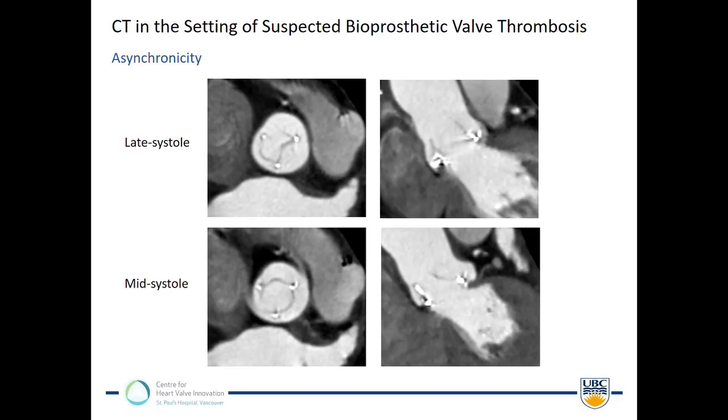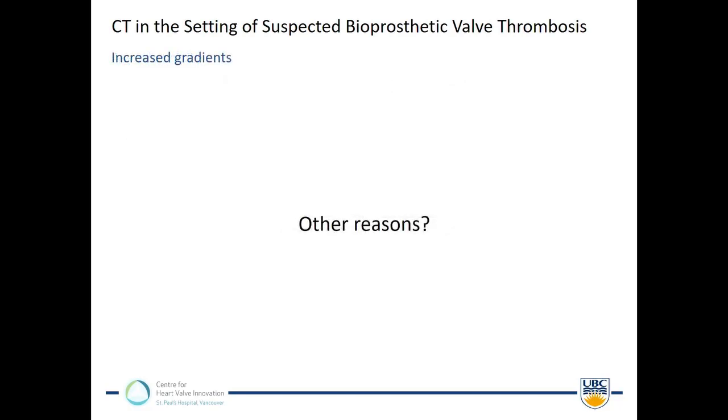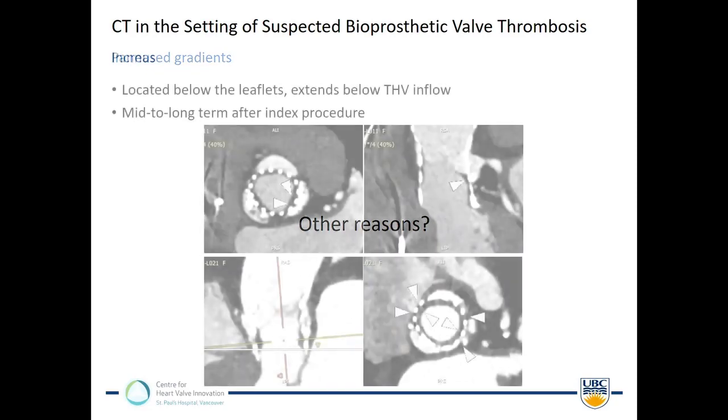And here's a case of a surgical bioprosthesis. In late systole, you see that 2 leaflets are still open, 1 is already closing, and that's a very common phenomenon, that there's an asynchronous motion. In mid-systole, all 3 leaflets are fully open. So if I had only 1 frame, I may misinterpret that as leaflet restriction. I think that would be an overcall or an incorrect diagnosis, so I would stay away from that. If you have a finding of leaflet thickening, then I think it's correct to also grade the degree of restriction, but not without thickening.